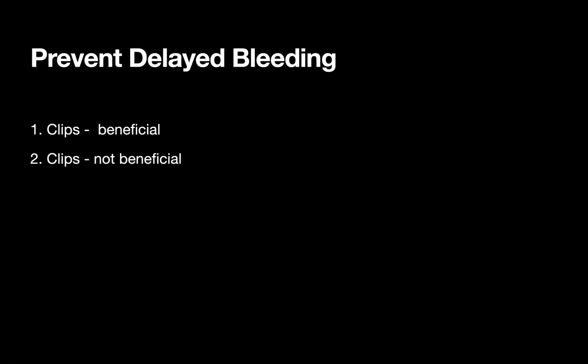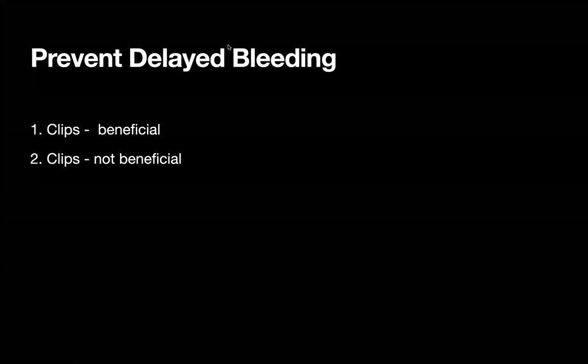All right. Sriram, what would you do? Before I close the case, before I get out of there, I would like to examine it for any visible vessels. If I can identify one, I'll use a soft coag to take care of it and leave it open.